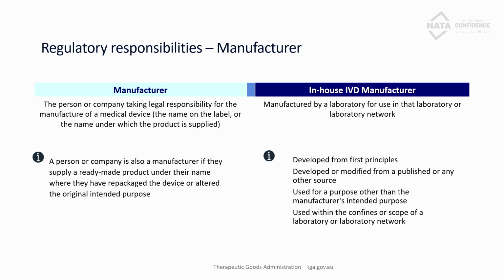I'll keep going. So, an in-house IVD manufacturer is also the manufacturer of the product. So, that's where the product is developed from first principles, or modified or developed from a published source, as you're all familiar with. So again, the manufacturer is assigning the intended purpose.